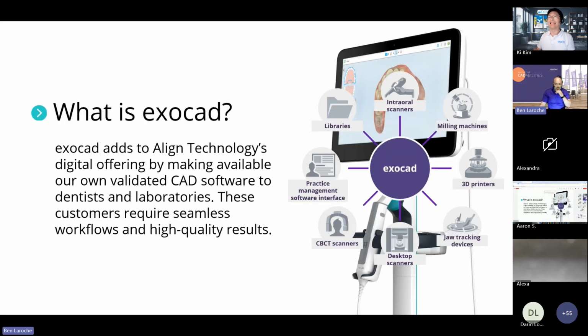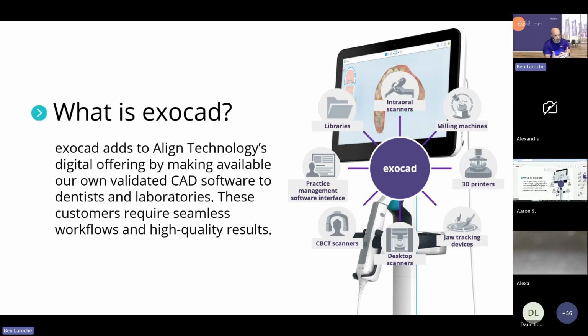First thing is, for those of you that don't know, what is exocad? And yes, we are part of Align Technology. The acquisition happened in 2020. Basically, exocad is kind of the nucleus of everything, in the sense that once you've scanned, that's great, you've got a digital file. What do you do after? If you want to manufacture, how do you create that design and then get it manufactured? So we're kind of in the middle of both sides, if you scan and want to design, and/or just design and then send to manufacturing.